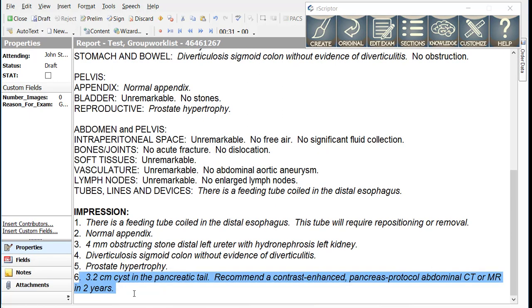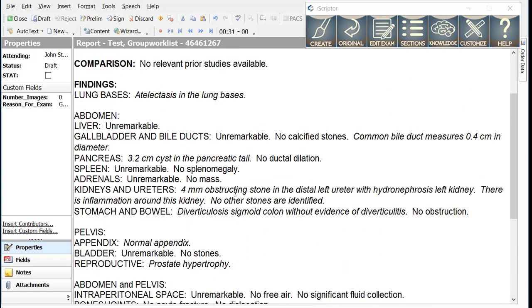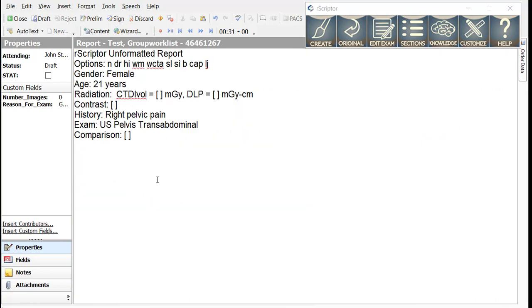We can also see that the presence of a cyst in the tail of the pancreas was also inserted into the report and the appropriate text was inserted into the impression along with the ACR follow-up recommendation for a cyst of this size in a patient of this age. Let's try some different reports using smart macros.